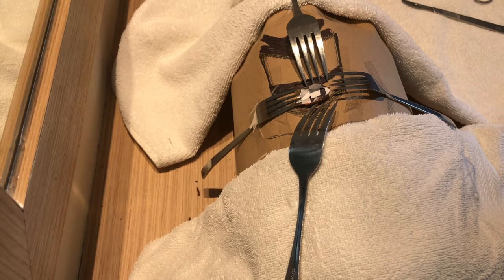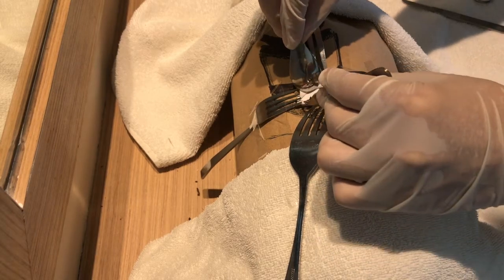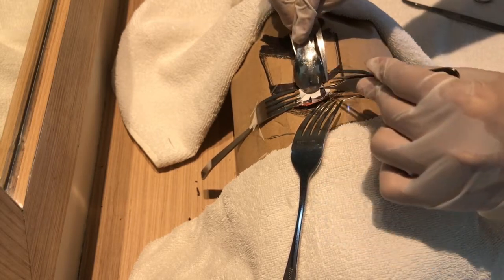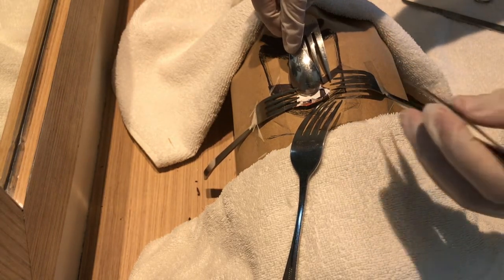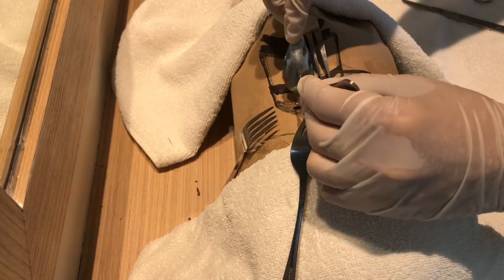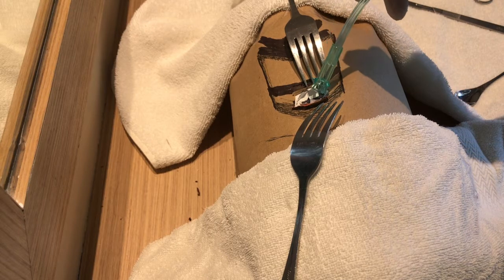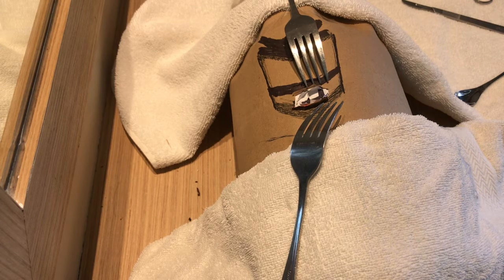Next is to retract the thyroid isthmus superiorly with the Langenbeck retractors to expose the trachea. So this is the trachea. Next is to expose the infrathyroid trachea. Ensure that the surgical field is completely dry before proceeding. In awake patients, inject lidocaine into the tracheal lumen prior to incising to reduce coughing.